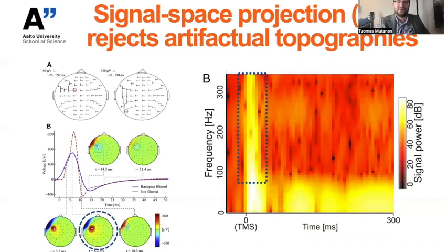And again, we use the physics and physiology, because the muscles are superficial and they are lying on the skull. We know that the frequency band at which their spectrum is observed in the EEG is much broader than the frequency spectrum of the neuronal signals, which are expected to be below 100 Hz. So if we look into the high-pass filtered data, we can use that to estimate the topographies of the artifacts that we can then project out with the signal space projection method.